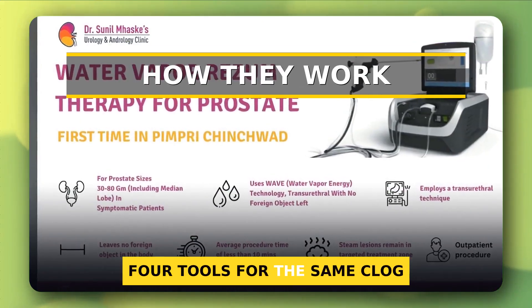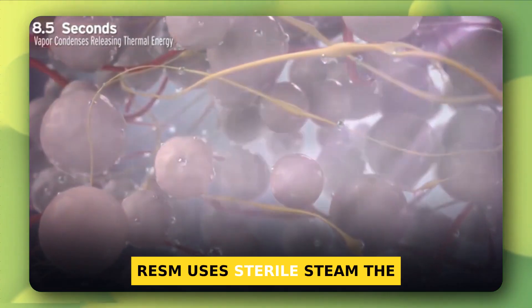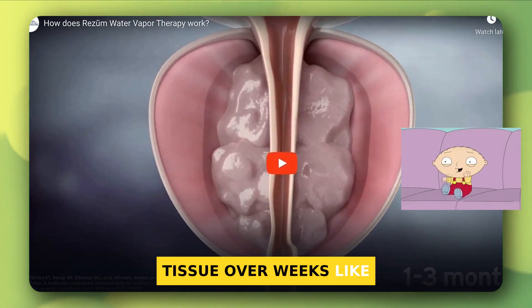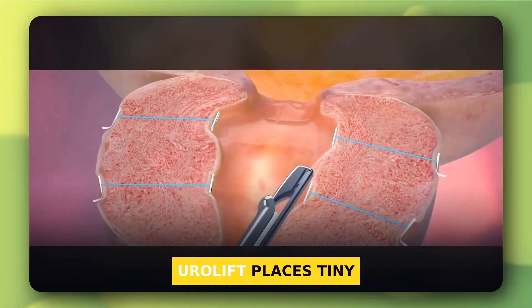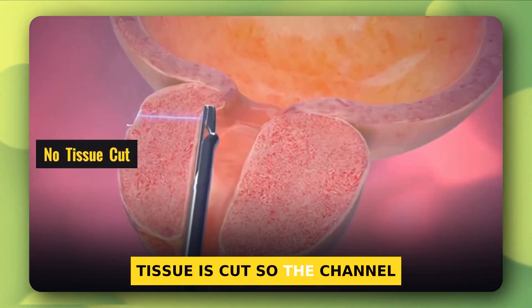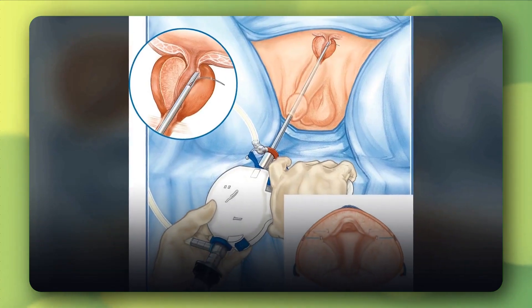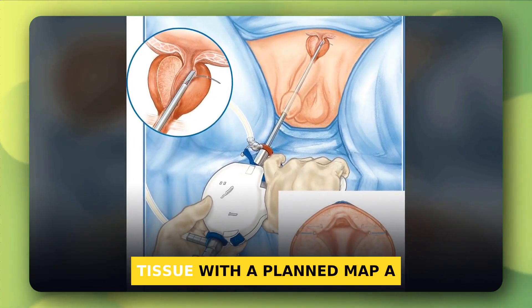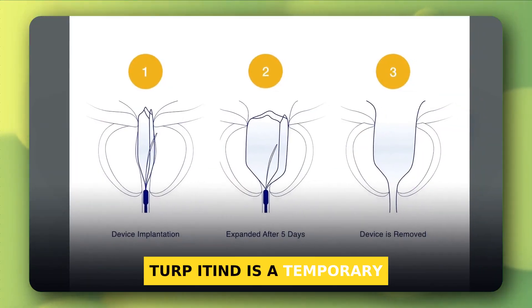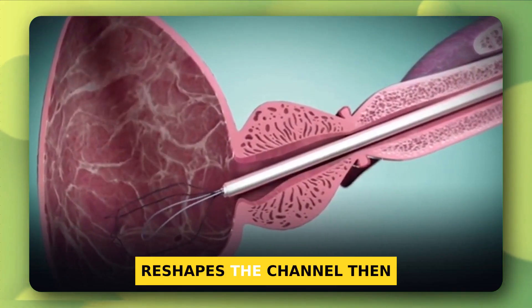Picture four tools for the same clogged channel. Each clears space in a different way, and that shapes recovery. Rezum uses sterile steam — the heat kills targeted cells, and the body shrinks that tissue over weeks, like steaming thick veggies so they soften. UroLift places tiny permanent implants that pull the side lobes open; no tissue is cut, so the channel opens like propping a tight straw. Aquablation is a robot-guided water jet; under ultrasound, a high-speed saline stream removes tissue with a planned map — a bit like a very precise mini-TURP. iTIND is a temporary nitinol stent that sits for a few days, spreads pressure at three points, reshapes the channel, then gets removed.